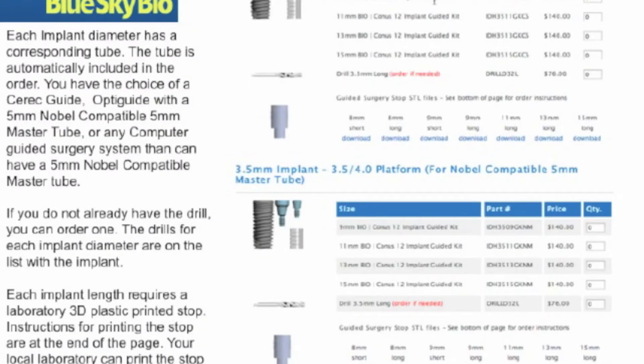The direct cut guided surgery system is now part of all of BlueSkyBio's osseous level implants. These do not require separate surgical guide purchases and can be used with the drills that are included with the BlueSkyBio surgical kit. Thus, the true idea of minimal inventory without purchasing extra parts and pieces can be realized no matter which implant system you're currently using.